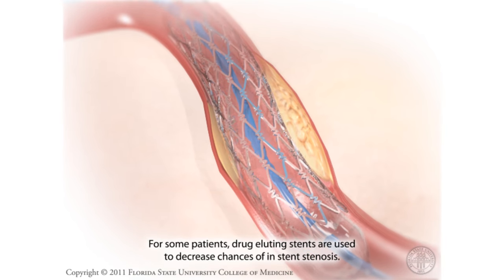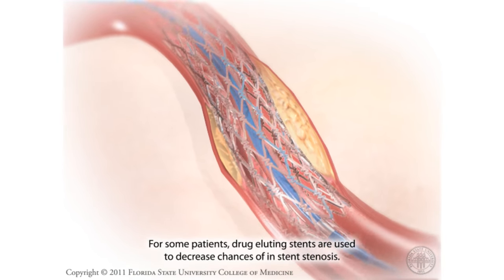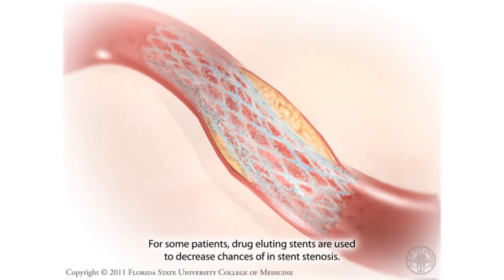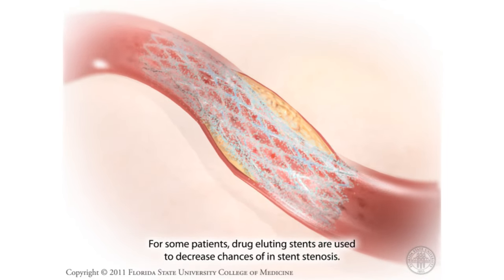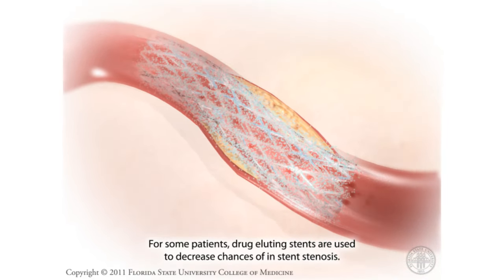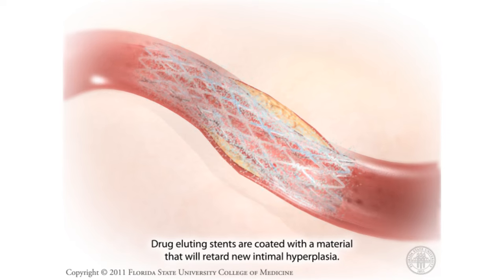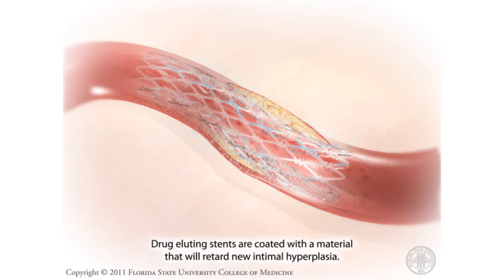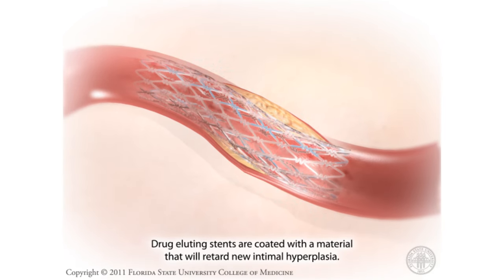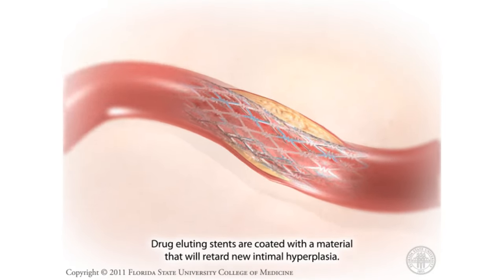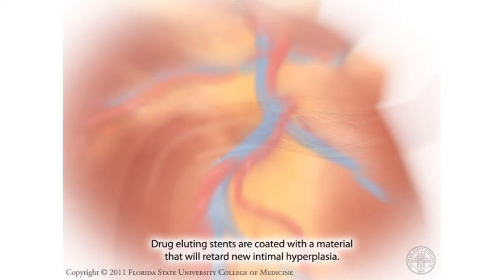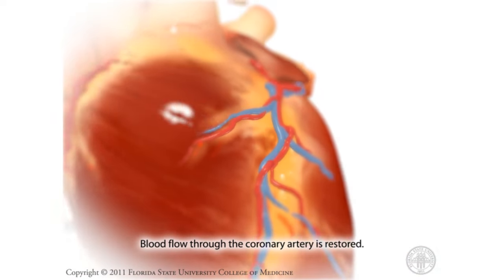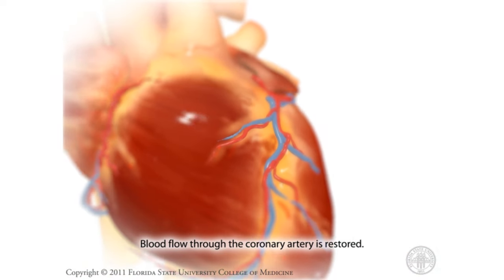For some patients, drug-eluting stents are used to decrease the chances of in-stent stenosis. Drug-eluting stents are coated with a material that will retard new intimal hyperplasia. Blood flow through the coronary artery is restored.